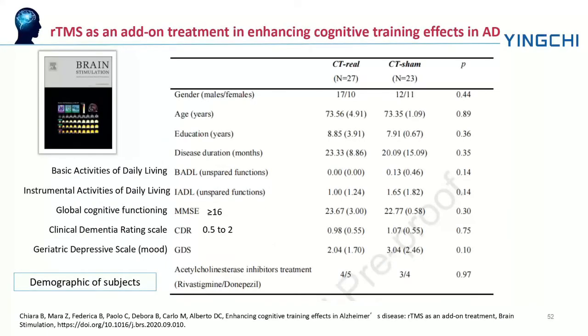And for rTMS used in patients suffering from AD, it can be used as an add-on treatment to enhance cognitive training.